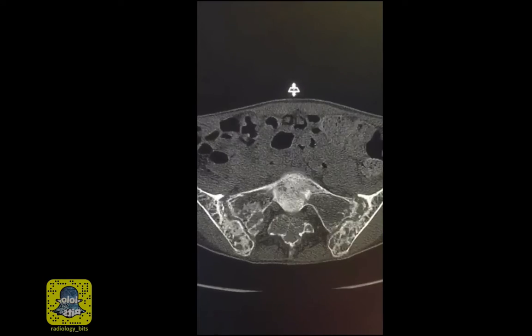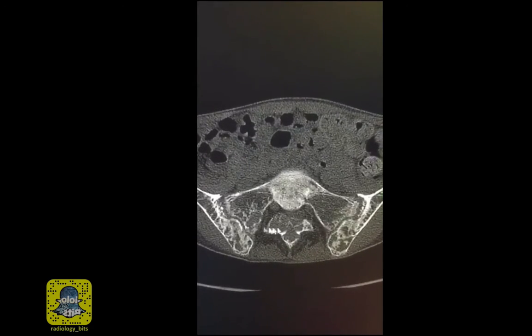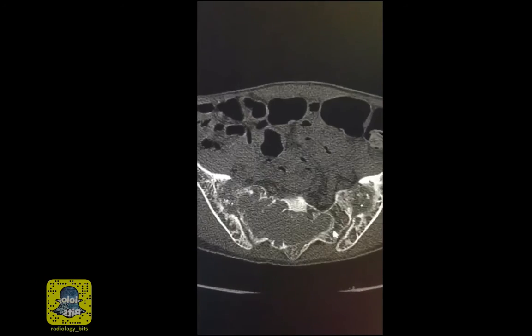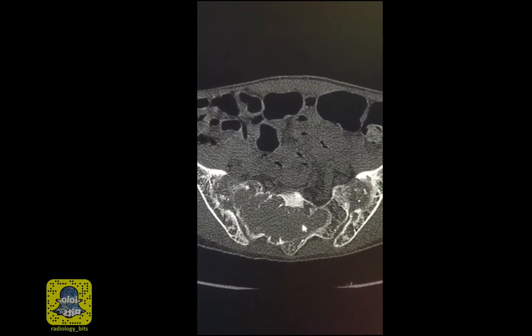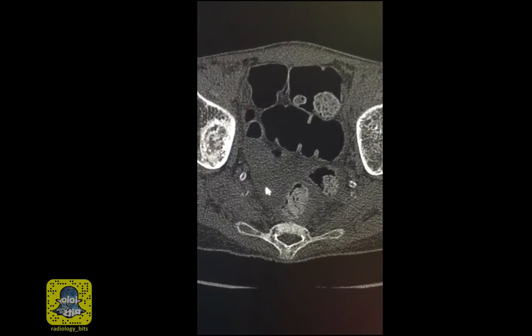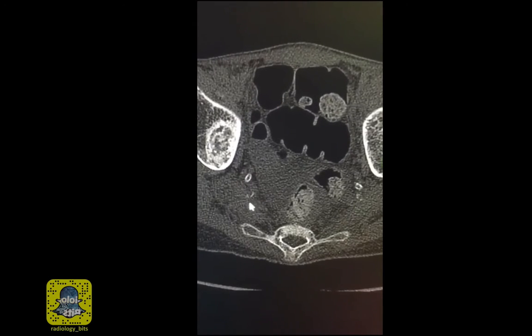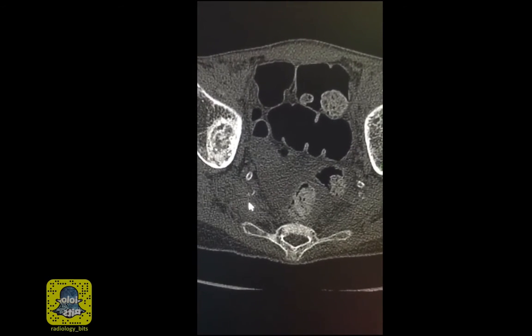The classic signs that you would see with hyperparathyroidism would be subchondral resorption in joints such as the sacroiliac joint and symphysis pubis. You may have focal lytic lesions with hyperparathyroidism known as brown tumors, which are not tumors, they're hemorrhagic reparative processes. Look for other hints for renal disease such as severe atherosclerosis even in small vessels, especially in a young patient.